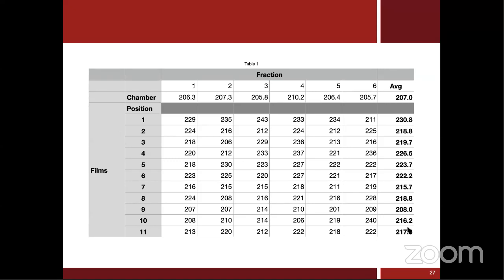could improve the reasons. One of the issues is that you cannot use these films, for example, on a patient with photon beams, placing the film on the skin without any buildup, because then the dose is going to be very low. It will not confirm anything. For electrons, maybe there is no problem. But films should not be used for low dose measurements.